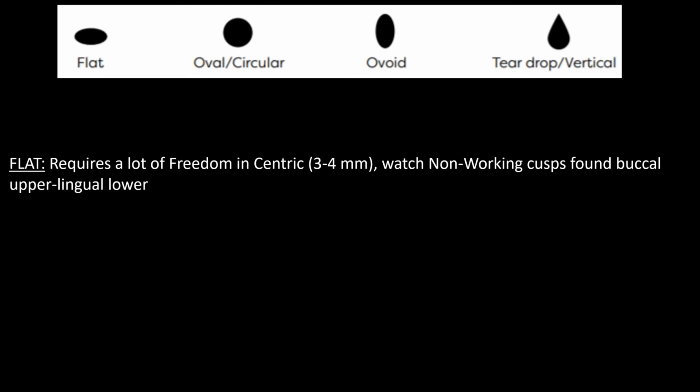So that's where this comes in, and the complaint of my new teeth are looser than my old ones. On the old ones, the dentition was worn flat, so their chew cycle had to be more flat and more horizontal, because they had to mill their food and chew like a cow, so to speak.